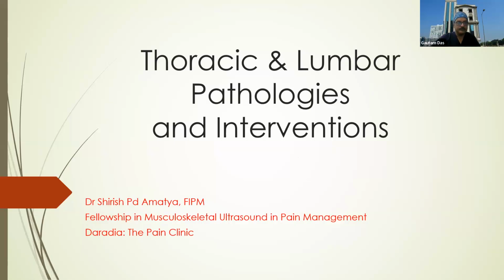Okay. So good evening, everybody. We are almost at the end of our class. Today, I'll be talking about some thoracic and lumbar pathologies as well as a few interventions that are commonly done in day-to-day practice. Let's start.